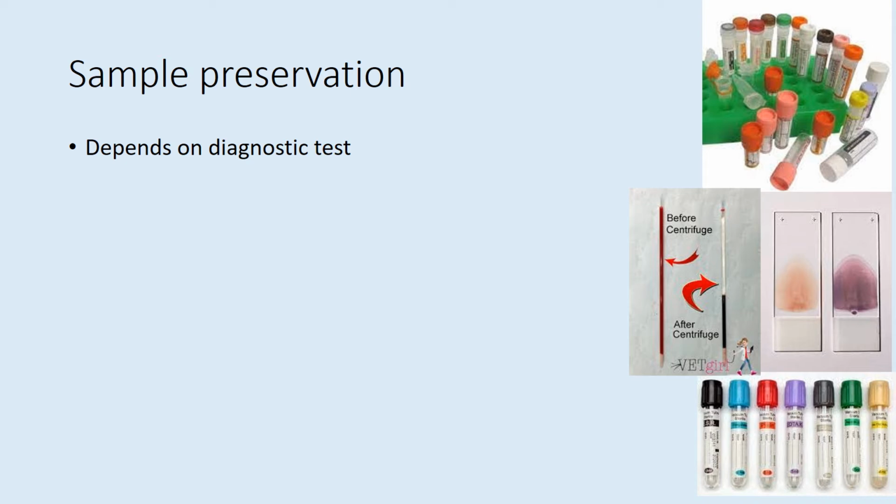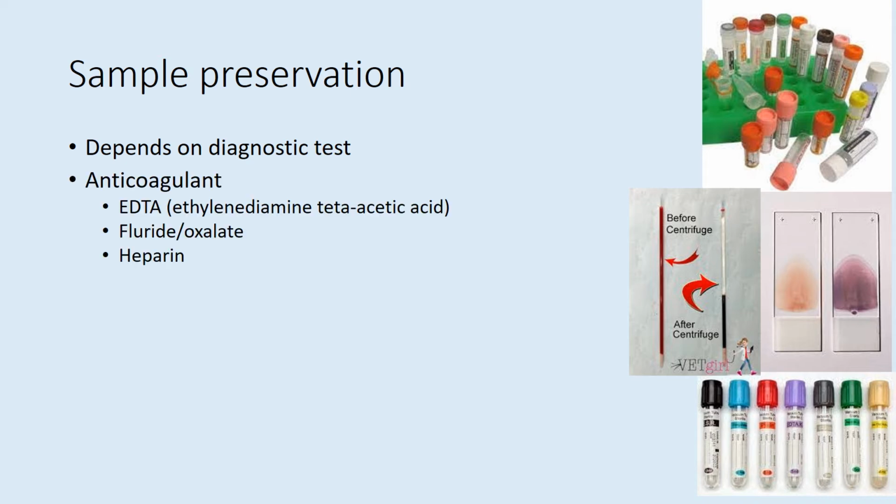The choice of container will really depend on the diagnostic test required. For example, it might be that the container contains an anticoagulant. An anticoagulant is a chemical that prevents clotting from happening, and there are a number of different ones that we might use.